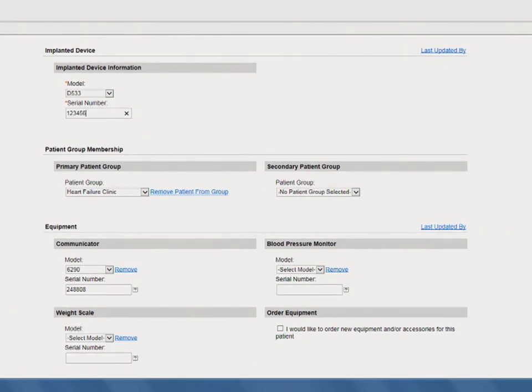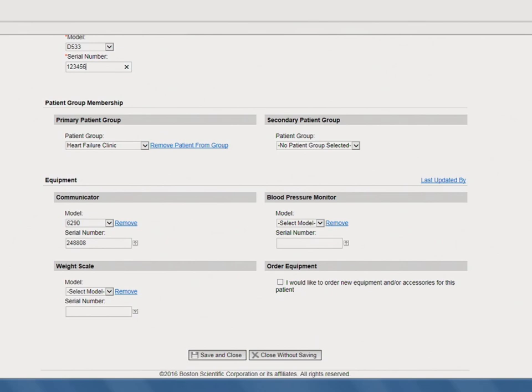Since the new implanted device is compatible with the patient's current communicator, you will not be prompted to update the communicator information. Select Save and Close to complete the process.